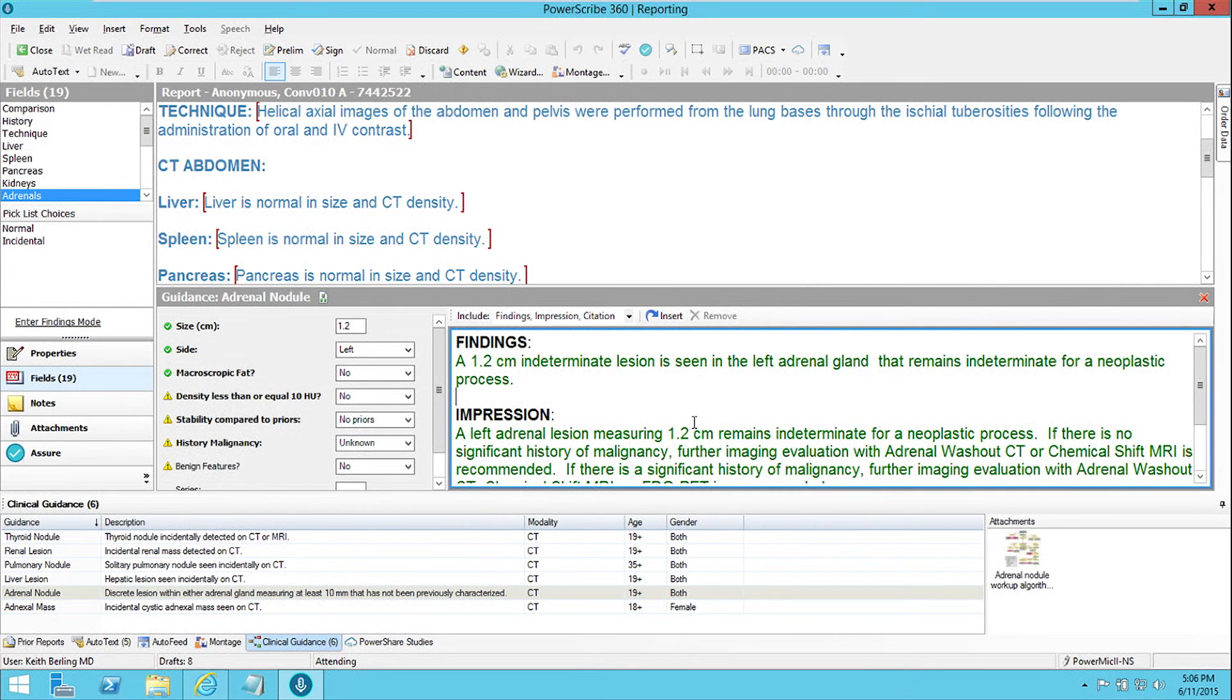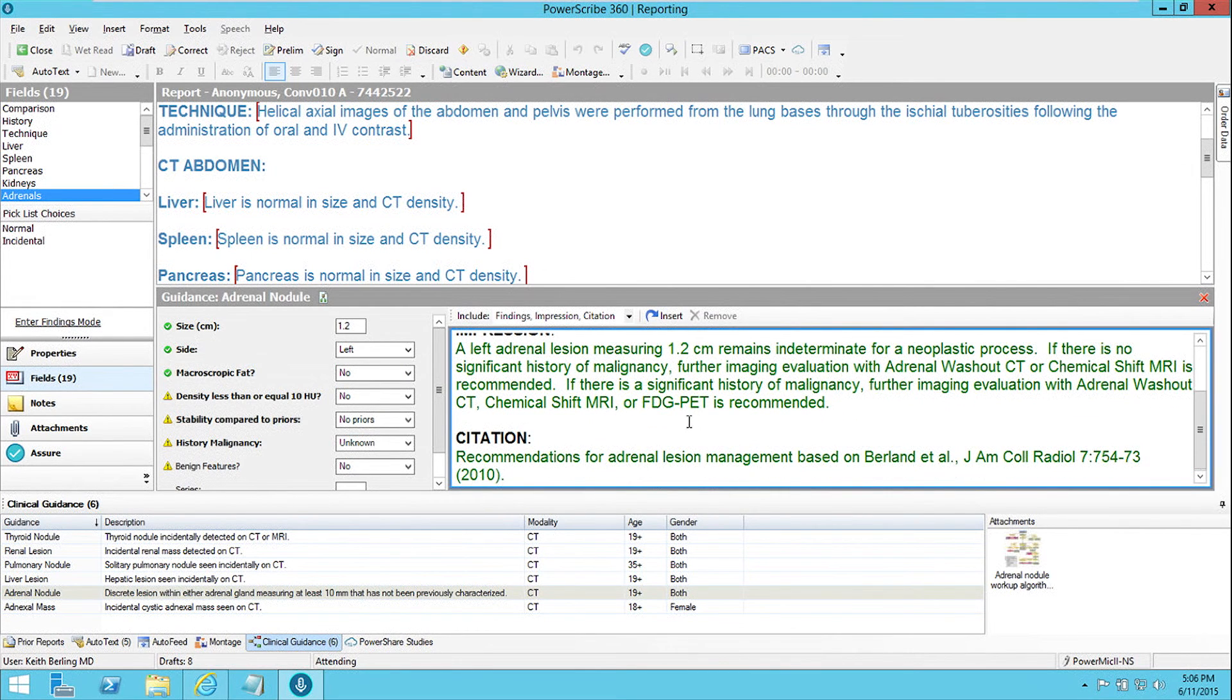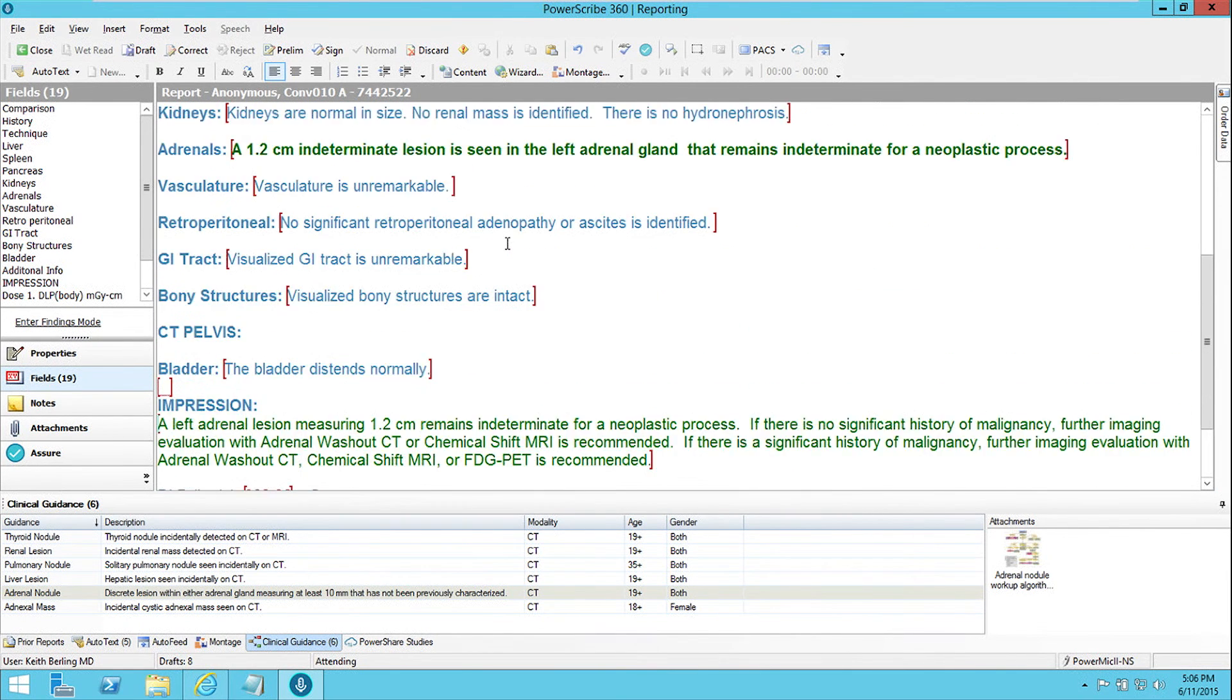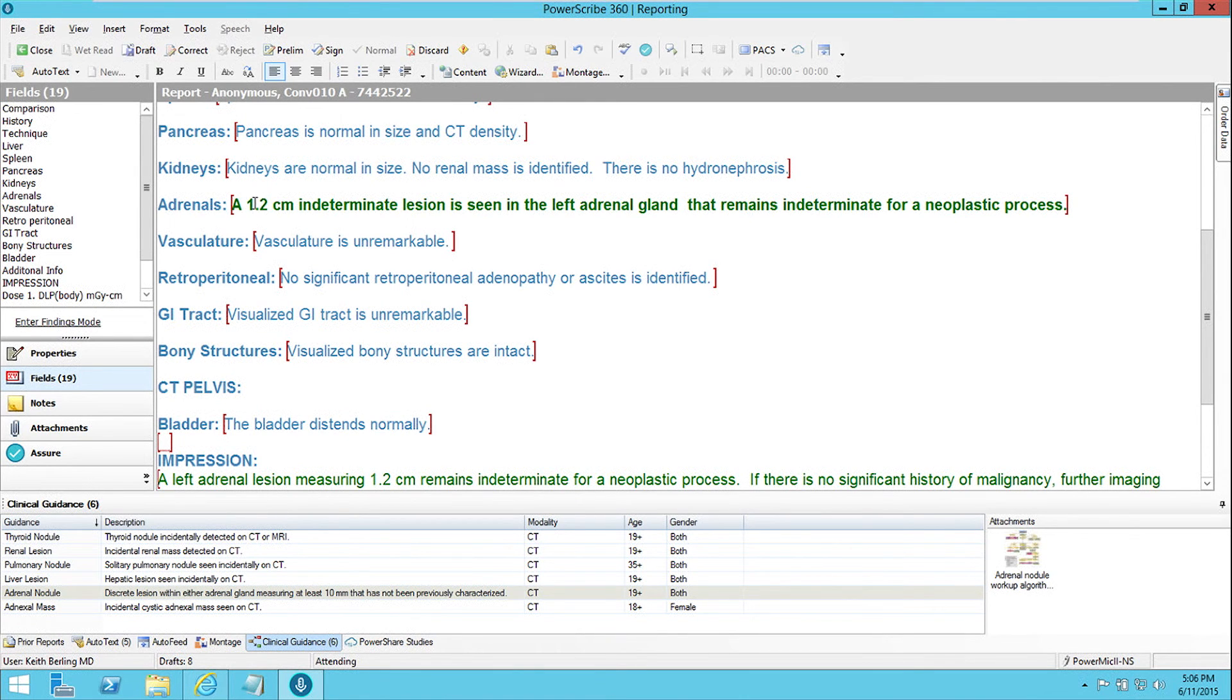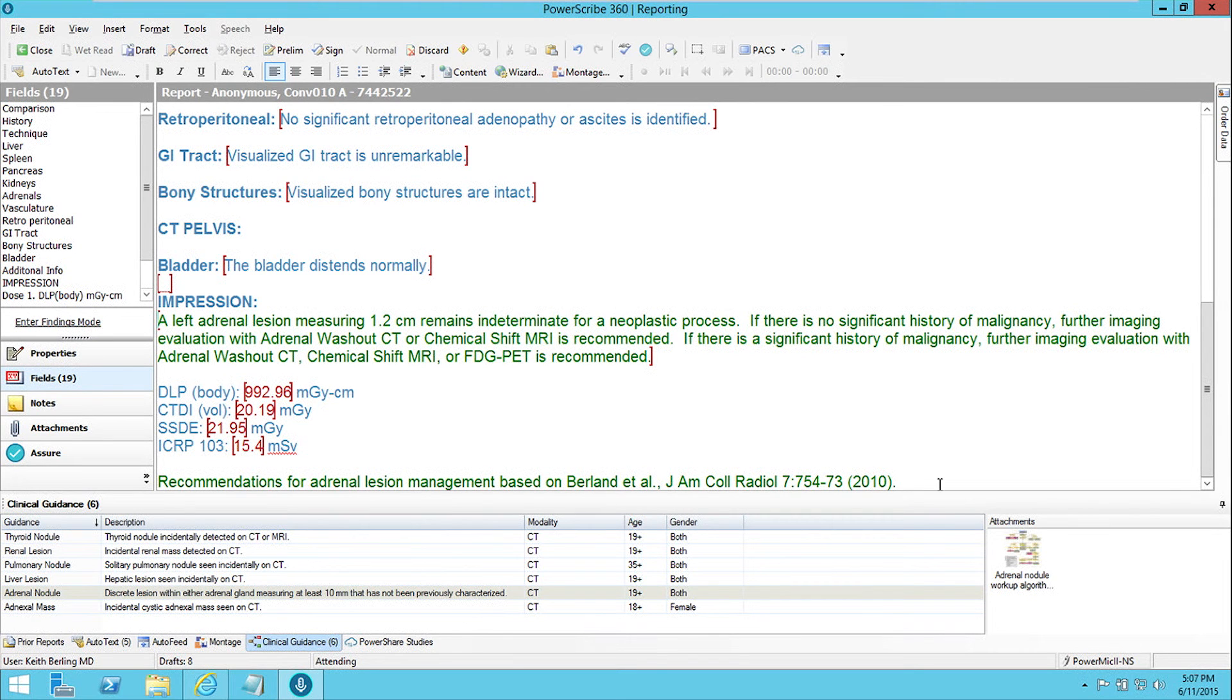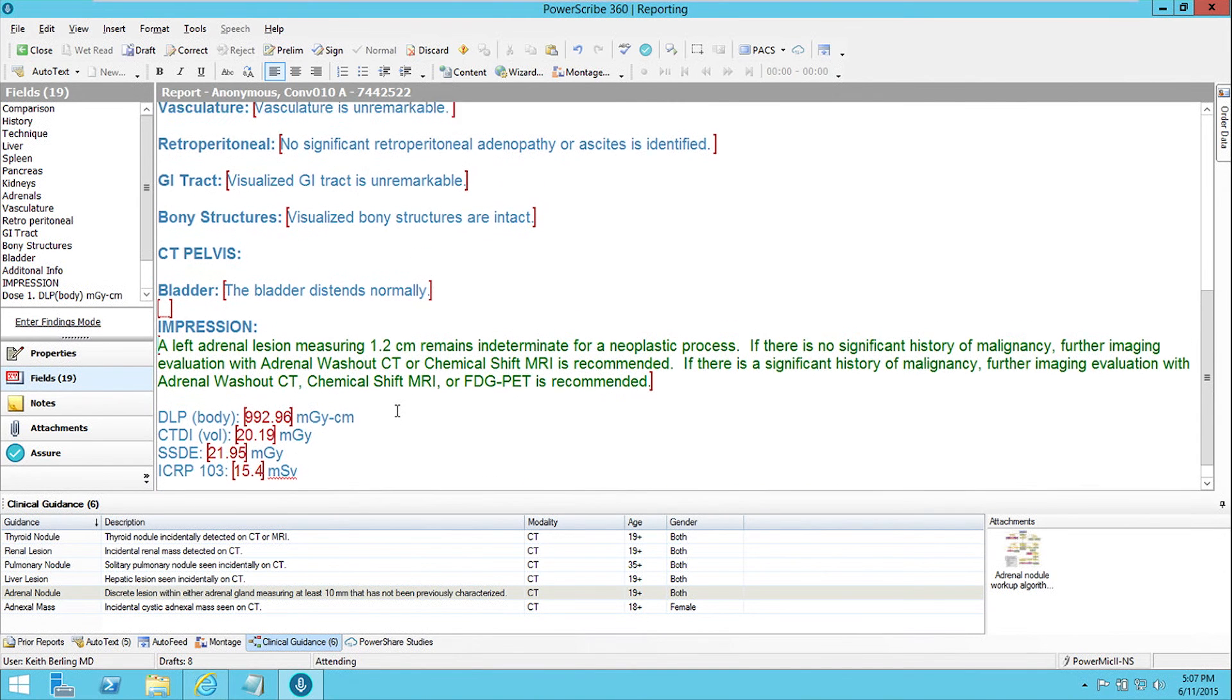So once we've gotten our description the way we want it, we just click the Insert button, and it automatically puts the text in the appropriate places in our report. So it puts the description in the adrenals field of our report, right where we had been when we started using the tool. And it puts the impression in the impression field and the citation for the source of our recommendations at the bottom of the report for us.